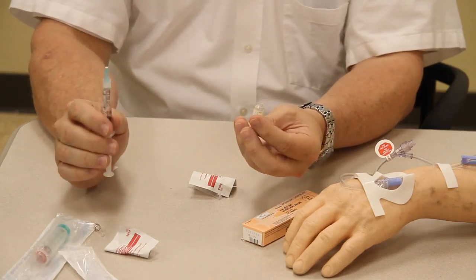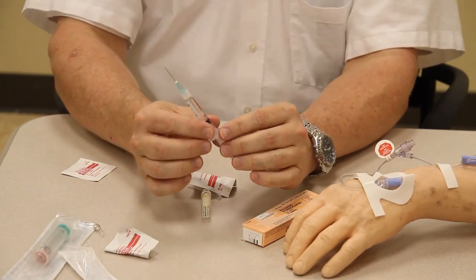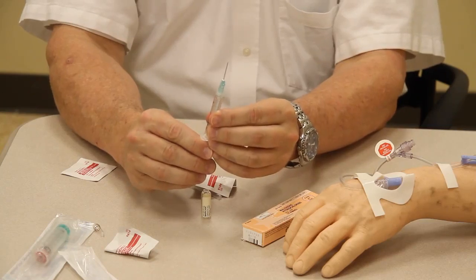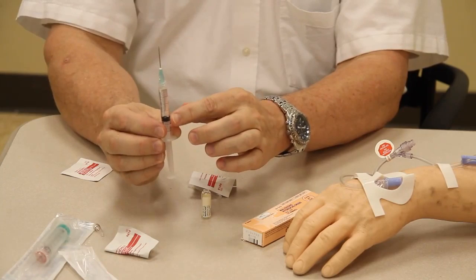Now what I'm being careful of is that I am only drawing medication, because if you stick the needle in too far, you can actually draw only air. But as you can see, I drew the medication out, okay? And now I have a full 2 cc's of medication in my syringe.